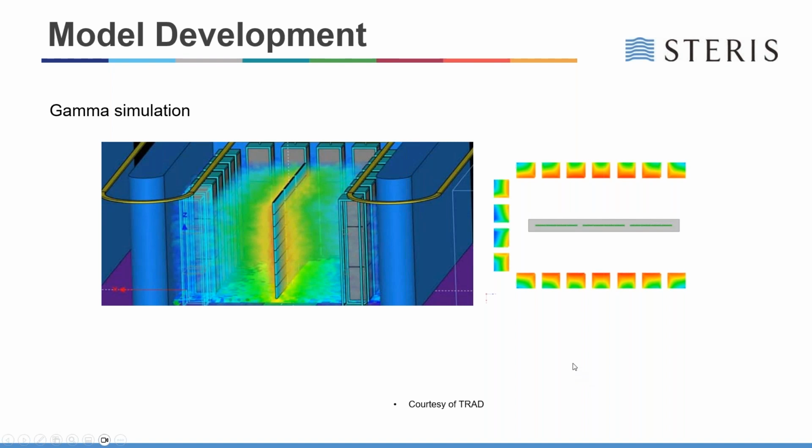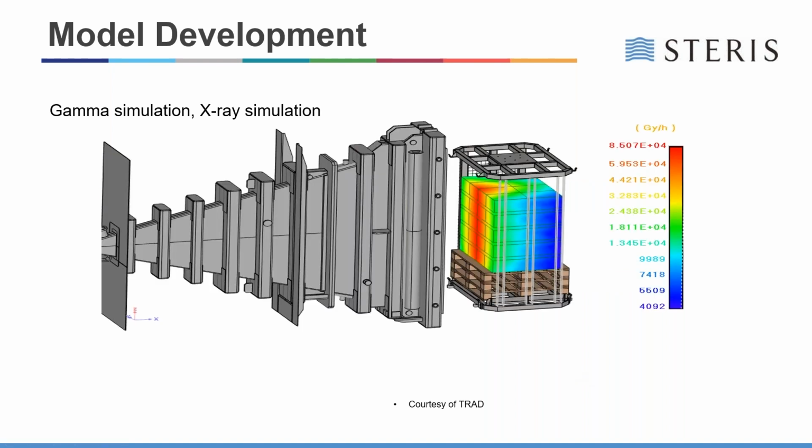Okay, next, let's take a look at the business end of an X-ray accelerator. This model shows how you can overlay the dose deposited within product directly over the CAD model. And this allows for a higher understanding of the control that goes into the dose delivered to a product.